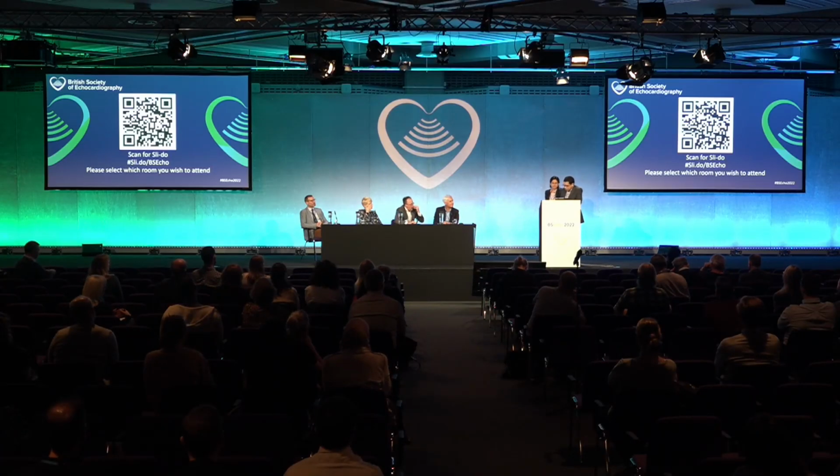Thank you. A question for Attila. You mentioned accurate measurement of LVOT and ways to do that, hybrid CT and echo. What about 3D echo of the LVOT?